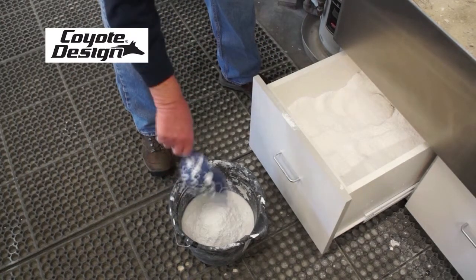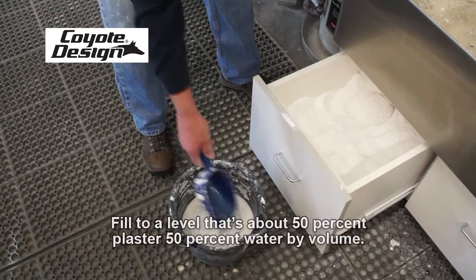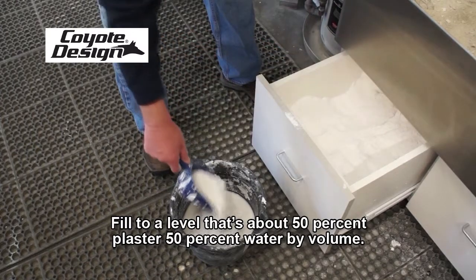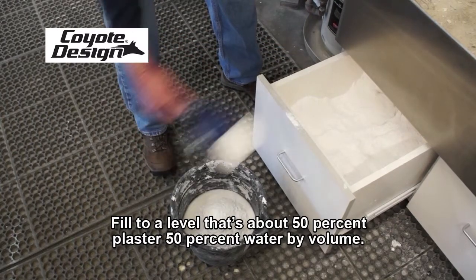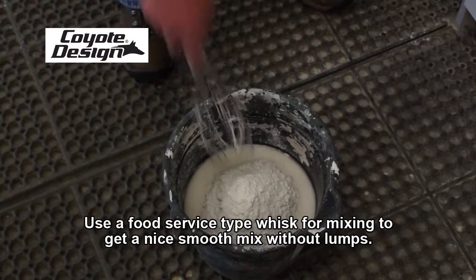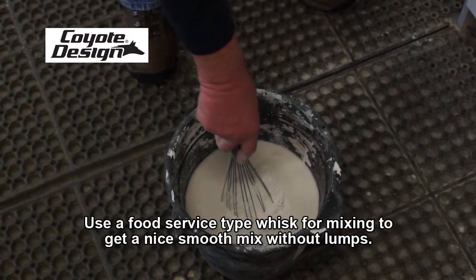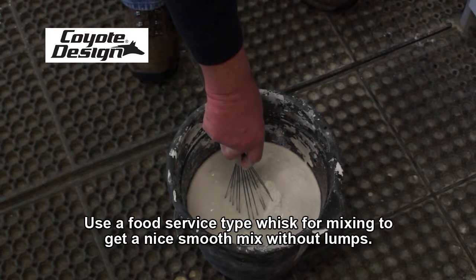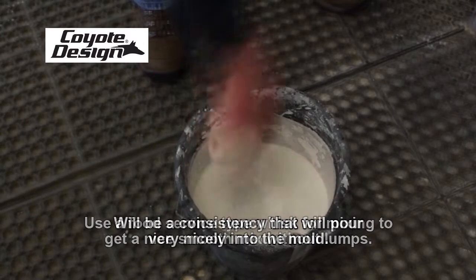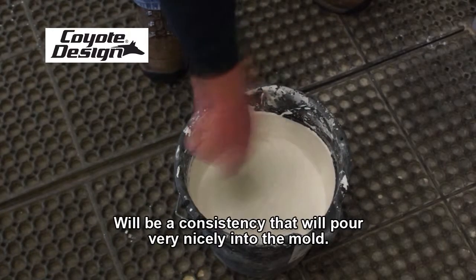We mound the plaster up on top of the water, filling it to a level that's about 50% plaster and 50% water by volume. We typically use a food service type whisk for mixing to get a nice smooth mix without lumps. Let it settle and soak in — the powder won't be too hard from too much plaster.